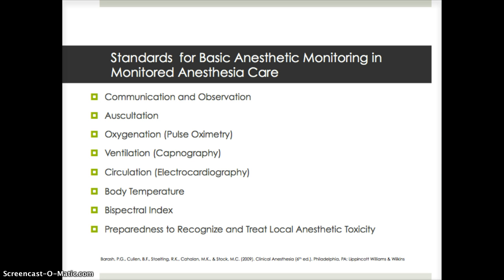At a minimum, the electrocardiogram must be continuously displayed throughout the anesthetic with the blood pressure and heart rate evaluated at least every 5 minutes. When clinically significant changes in body temperature are intended, anticipated, or suspected, body temperature monitoring must be used in order to facilitate the maintenance of normothermia. Bispectral index monitoring, although not a standard, may be used as an adjunct in evaluating a patient's response during drug-induced anesthesia and sedation. The absence of recall is associated with values below 80.